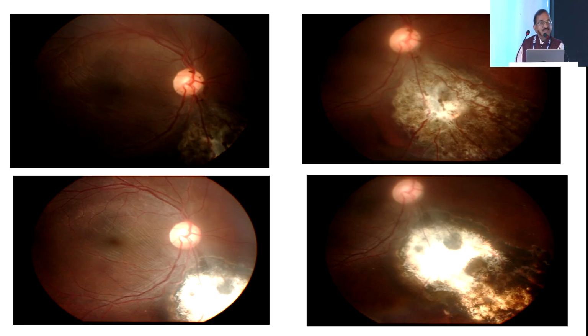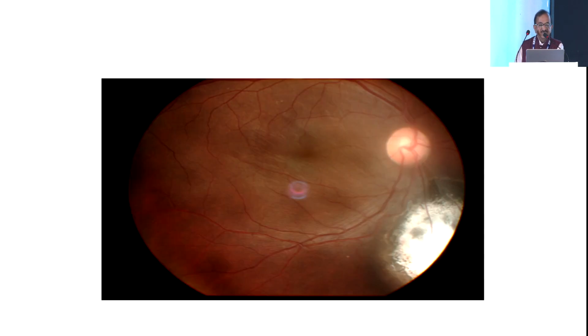And this is an intraoperative photograph which showed a retinal tear, and there was a large mass of fibrous tissue with hemorrhage there, just distal to the vitrectomy cutter tip. We did laser around that impact, around the foreign body tear, and then we did a chorioretinectomy, as you can see here, because it was largely extraocular. You can see the ILM folds at the macula, but he retained fairly good vision.